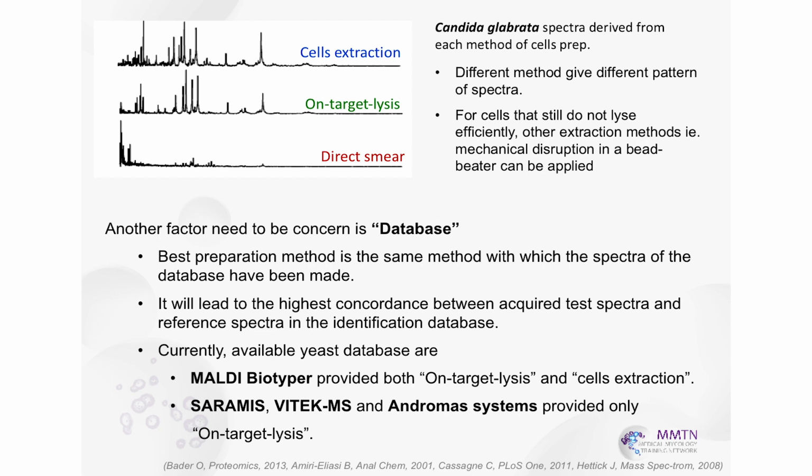Okay, any questions? No questions, right? So this MALDI-TOF Biotyper provides both extraction here, and this other one provides only this process. I just give you the information and you have to think about this.